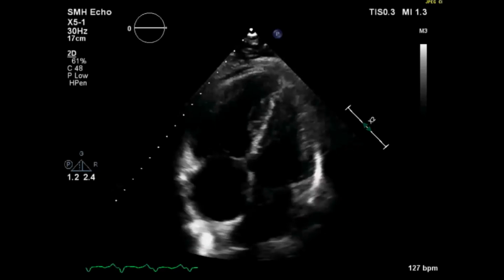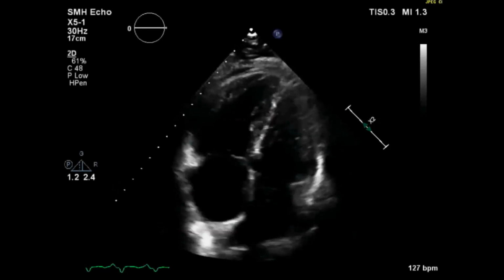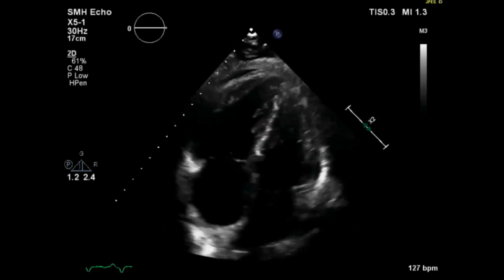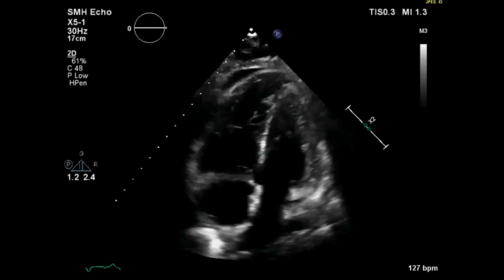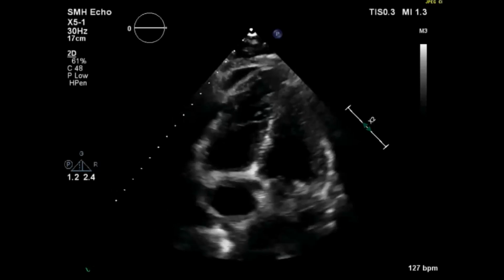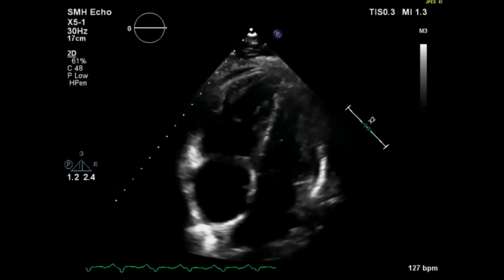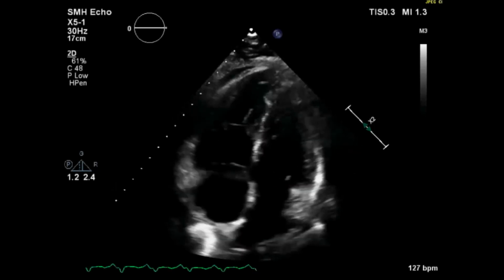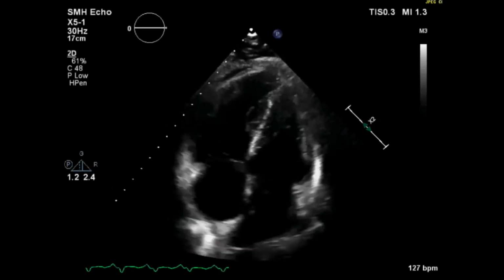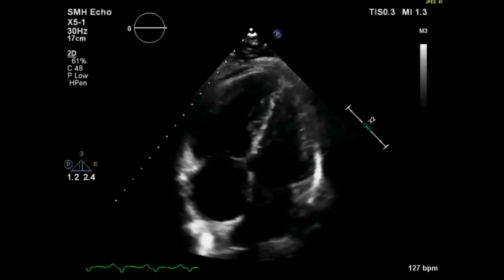That also affects the side of the artery, because we have three parts of the artery. Yeah, that's actually a curious one. I don't know why. I don't know if there's any data on it. The initial study by McConnell actually only had patients with pulmonary arterial hypertension versus pulmonary embolism. Then we examined other causes of RV dilatation or overload, like RV infarct.